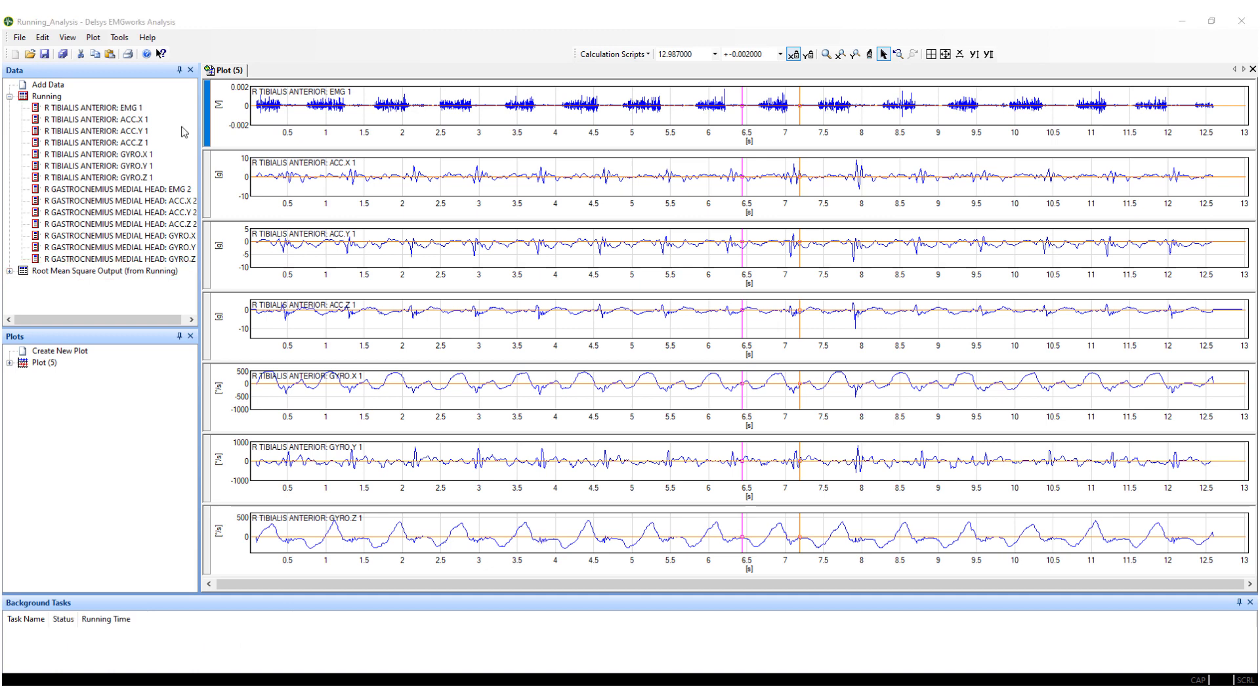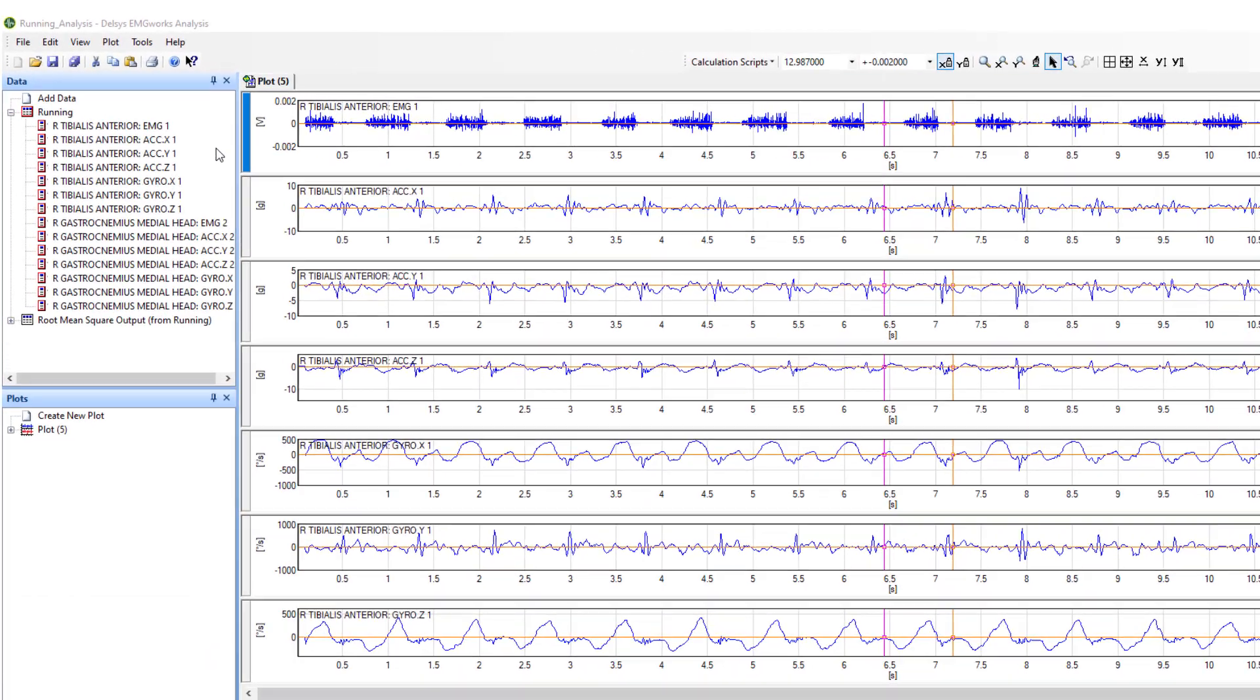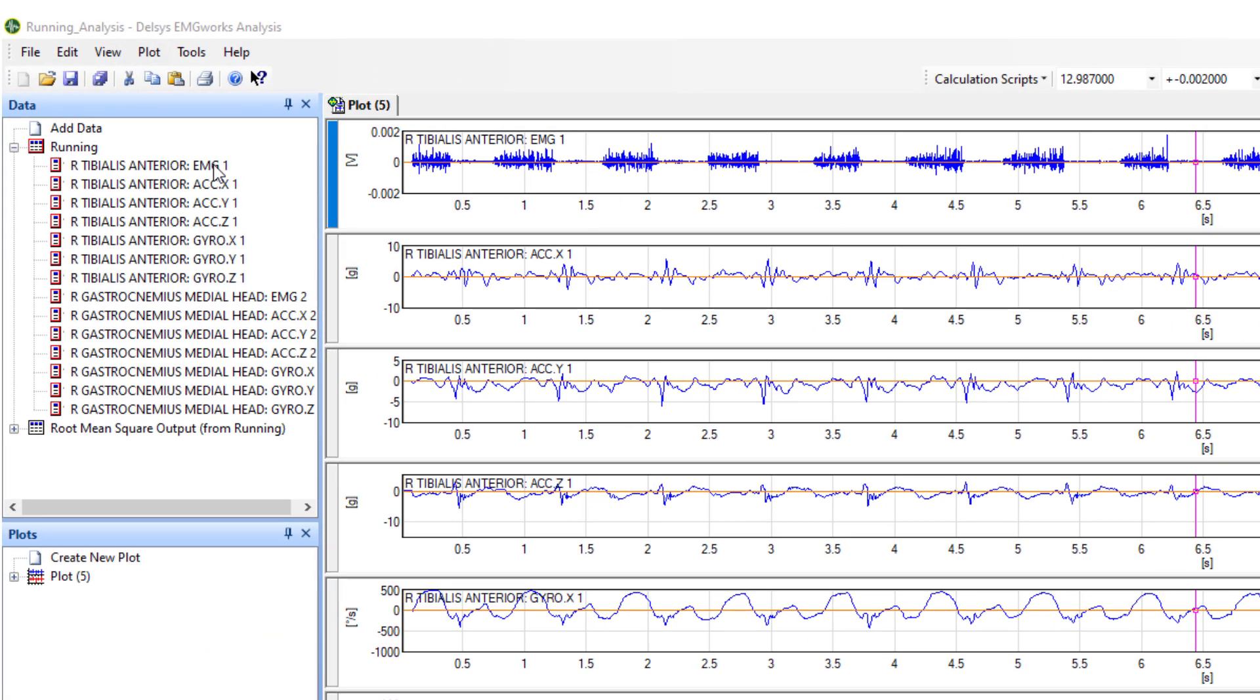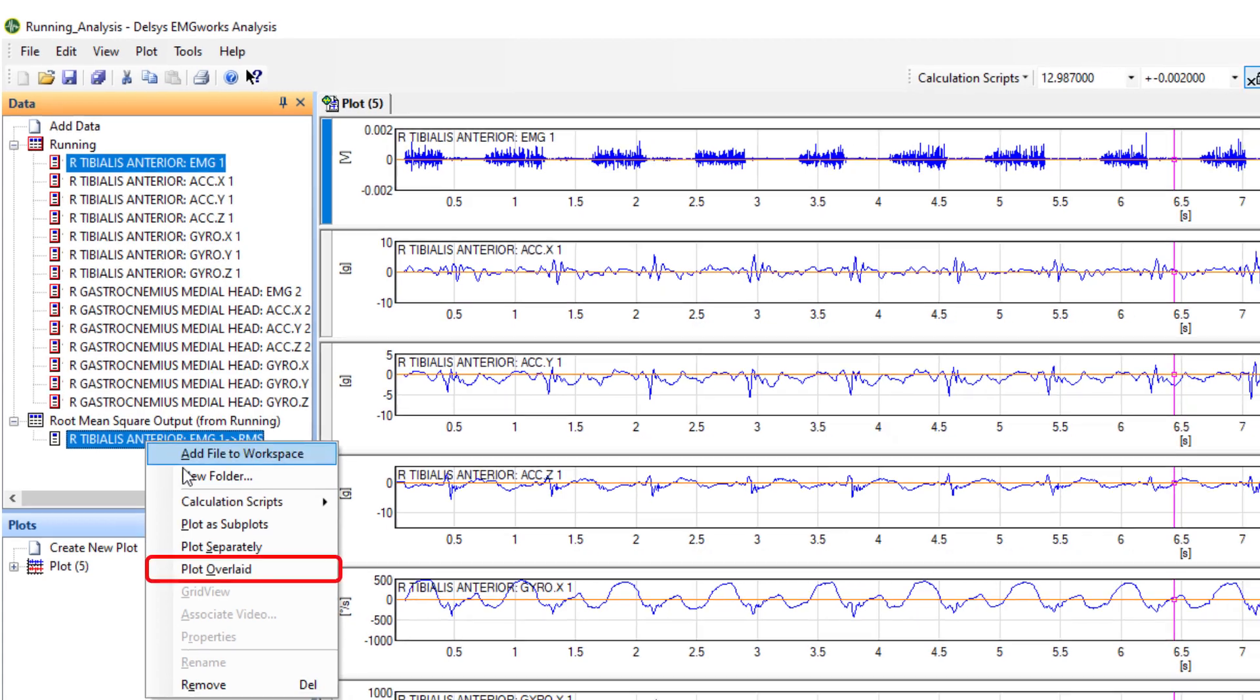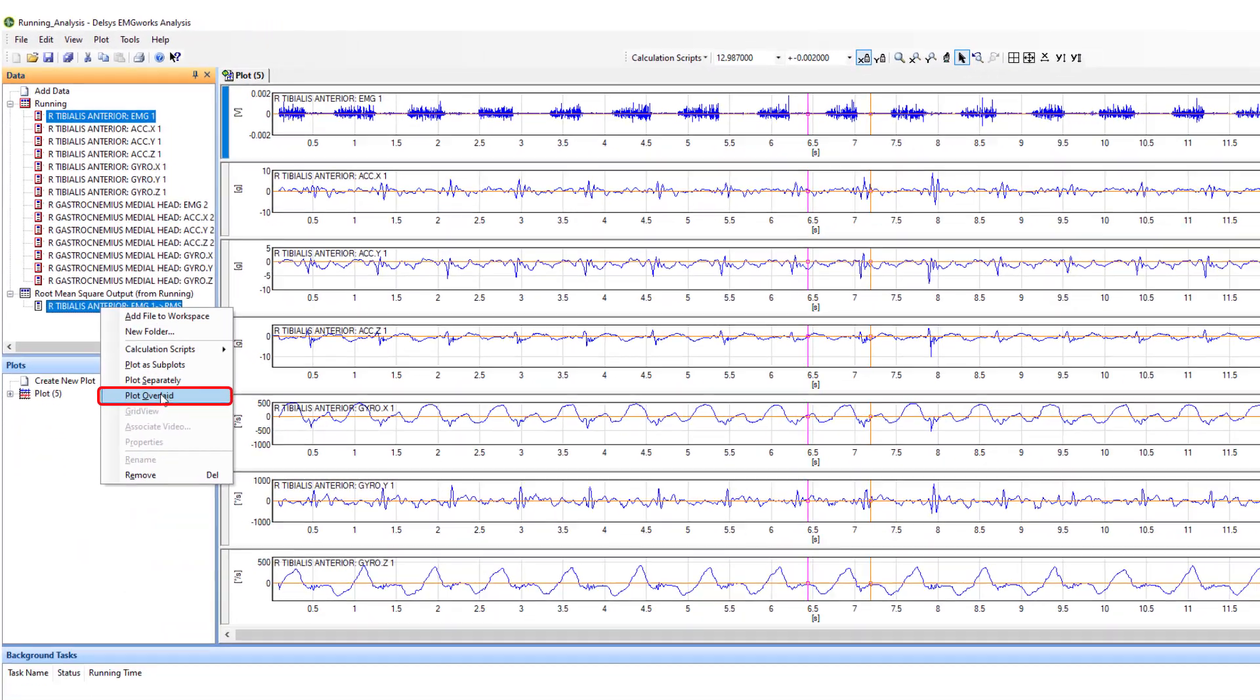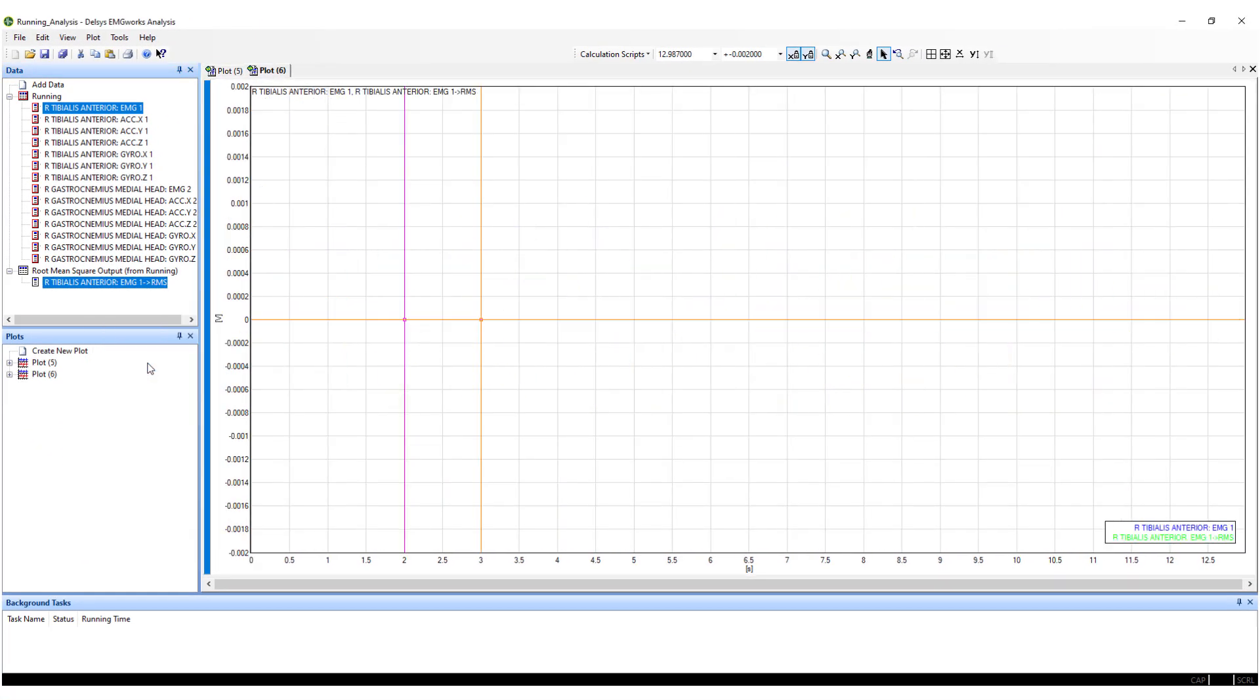RMS computations are typically overlaid versus their raw EMG signals. You can plot this by left-clicking on the raw data channel, pressing CTRL, and left-clicking on the RMS data channel. Right-click and select Plot as Overlaid.